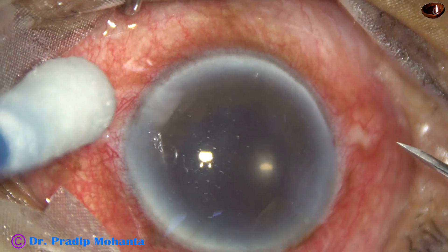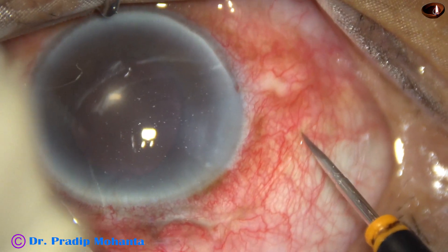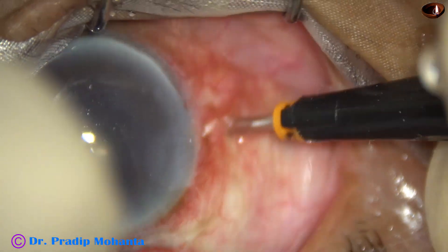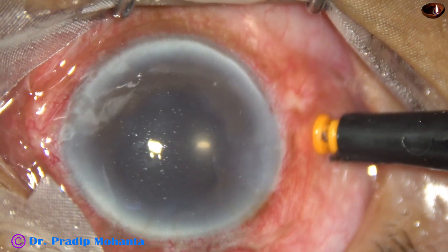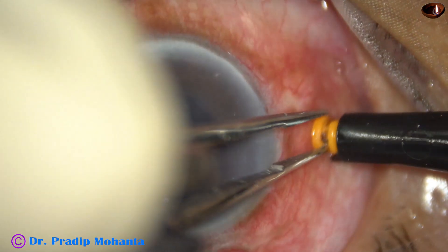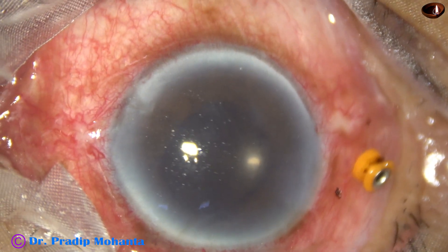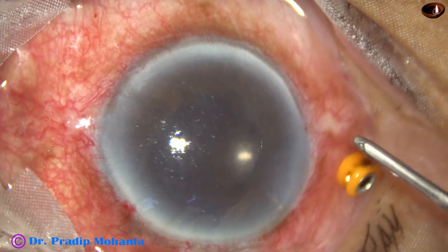The anterior chamber is flat. The patient has undergone cataract surgery — SICS — elsewhere, and has come with very high intraocular pressure, flat anterior chamber, and the iris is plastered to the back surface of the cornea.